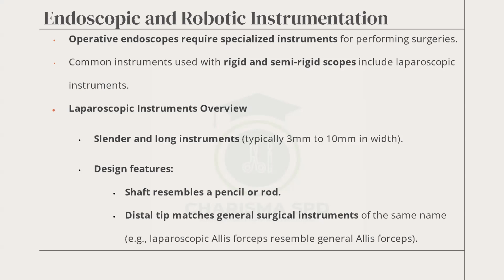The laparoscopic instrument can be dismantled, can be disassembled. You have to break them into the various components so that you can thoroughly clean them. When we get there, I'm sure down the line we'll see those laparoscopic instruments. They are typically slender and long. They are very long; some of them could be 10 inches, some of them could be 5 inches.